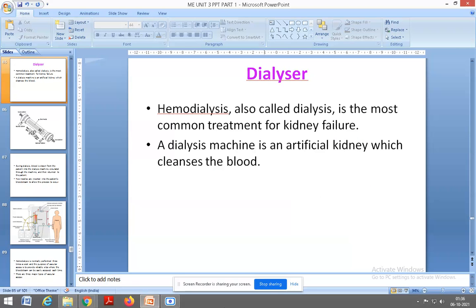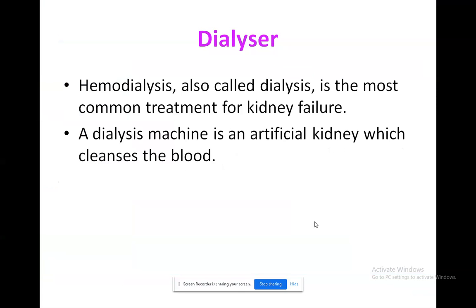Okay, next topic, dialyzer. So I think you all know what a dialyzer is, which cleans the blood in your body through an artificial kidney. This treatment is used in the case of kidney failure. Hemodialysis, also called dialysis, is the most common treatment for kidney failure.